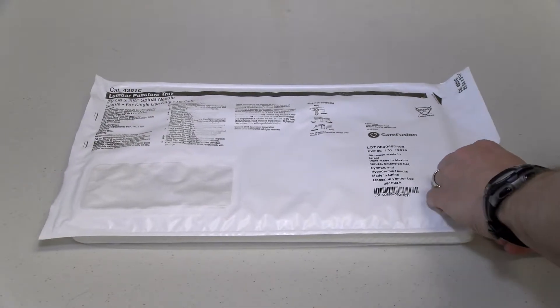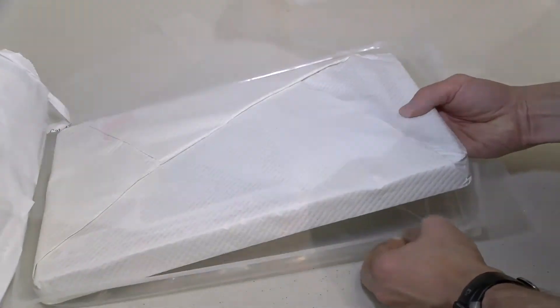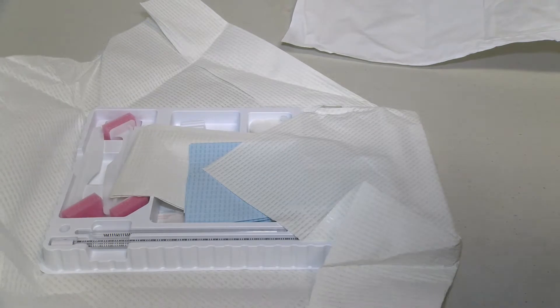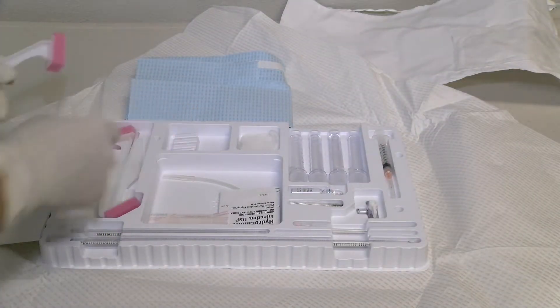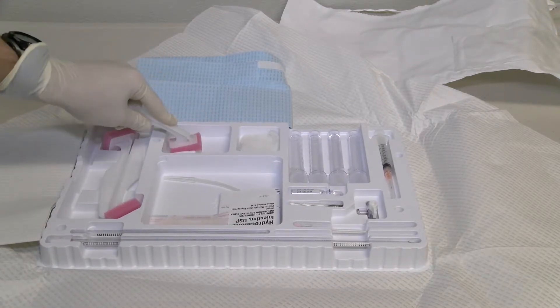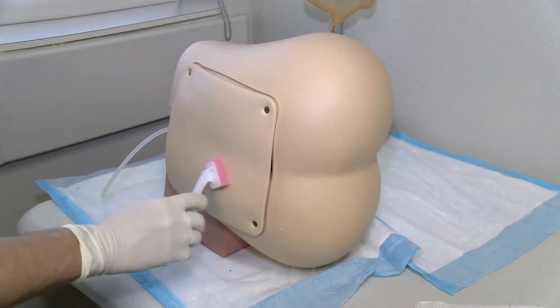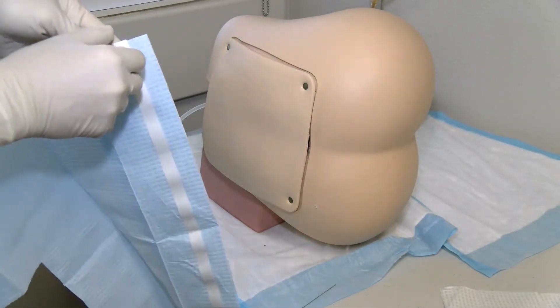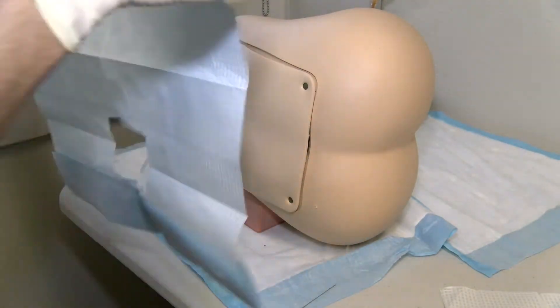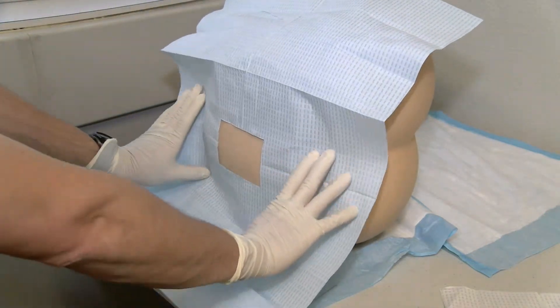Begin by opening the sterile kit on a nearby surface, then place a face mask and sterile gloves before beginning the procedure. Some kits may require the addition of chlorhexidine or betadine if not included, but most commercially available kits have all the materials required. Begin by cleansing the skin with betadine or chlorhexidine, then place a sterile drape over the area. Be sure to clean a space large enough to allow selection of a new site above or below the initial vertebral interspace selected.